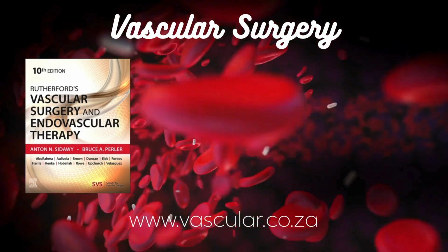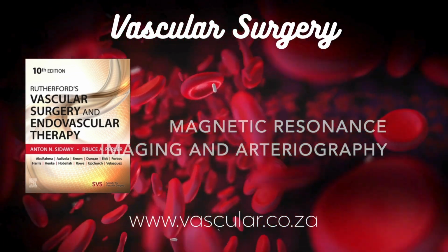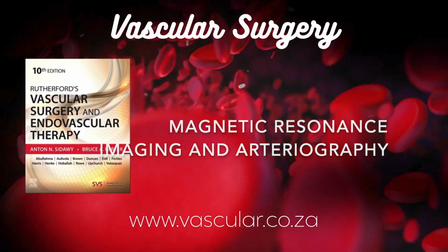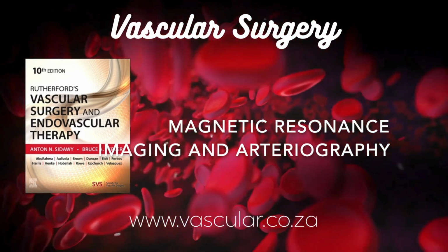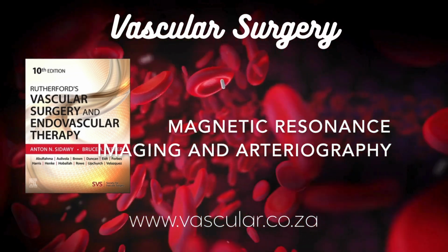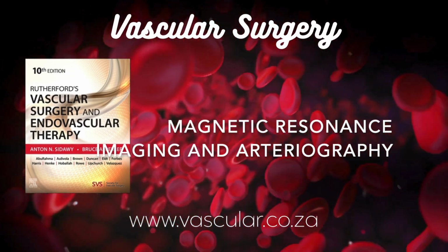Often, yes. Now, for MRA, magnetic resonance angiography, which is focused on arteries, and also MRV for veins, we generally rely more on T1 weighted image sequences. Why T1 for vessels? Because on T1 weighted images, certain things naturally produce bright signals. This includes fat, methemoglobin, which you find in slightly older blood clots, the effects of blood flow itself, and crucially for contrast-enhanced MRA, the MRI contrast agents we inject.